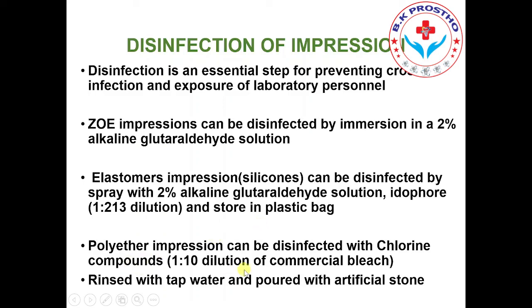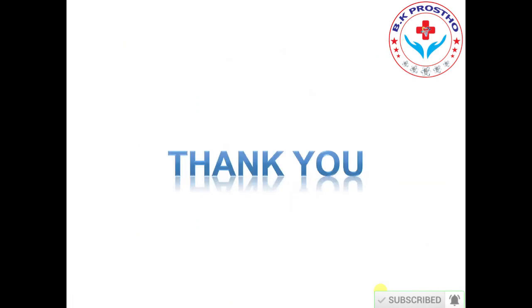Polyether impression material can be disinfected with a chlorine compound, a 1:10 dilution of commercial bleach, for 10 minutes, and afterwards rinse with tap water, remove the water, and pour with artificial stone. Thank you very much.